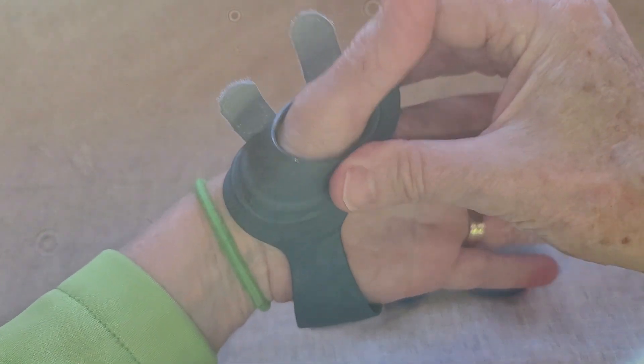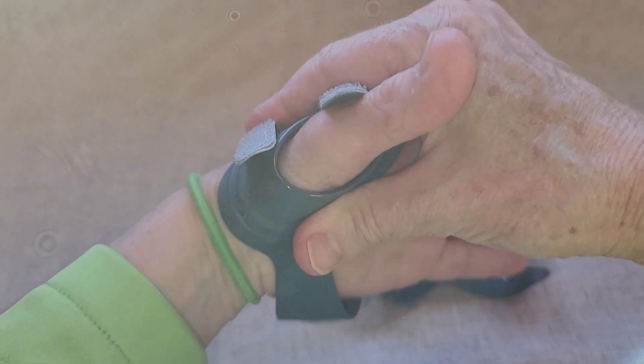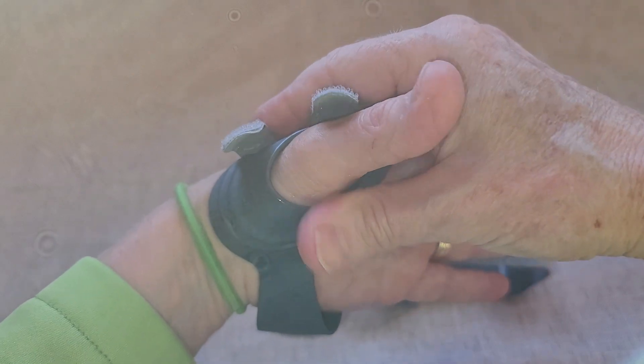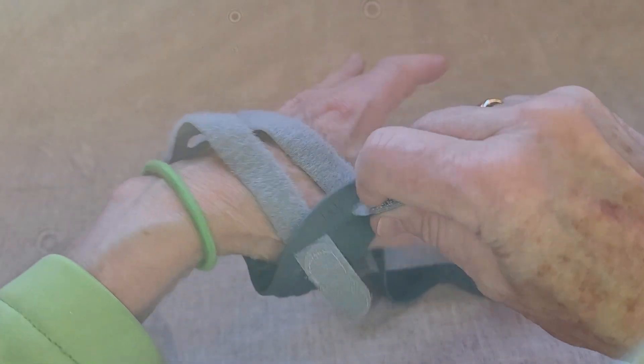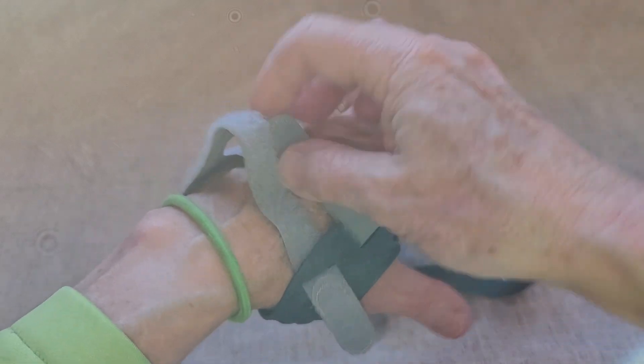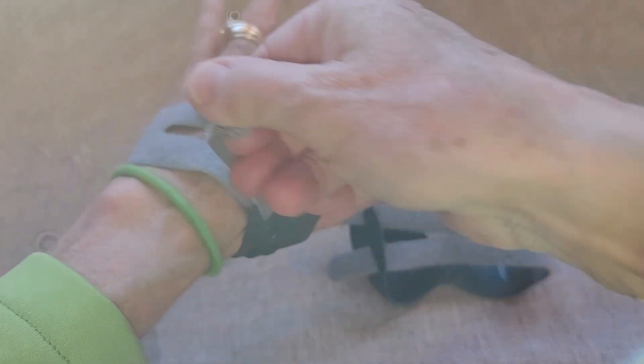What you do is after you put it on, you just squeeze it gently here so that it really snugs into your thumb. And then this is just a Velcro closure. You just flop that over there and put this over there.